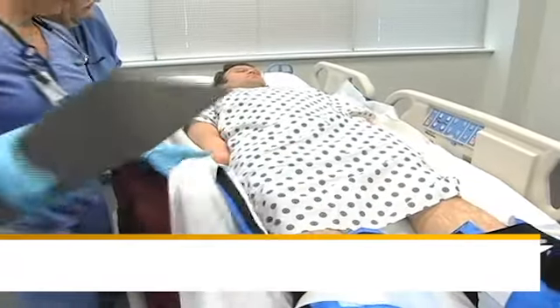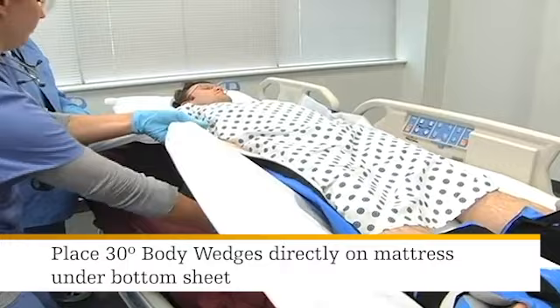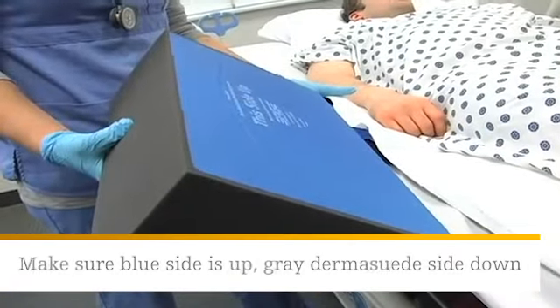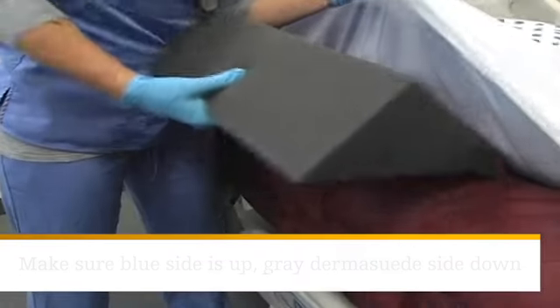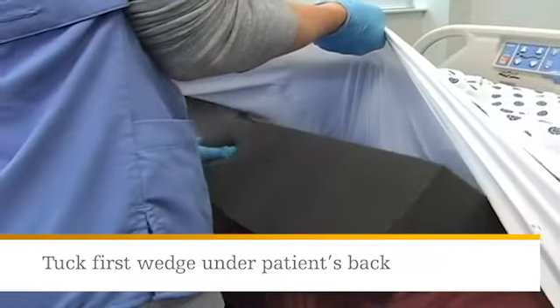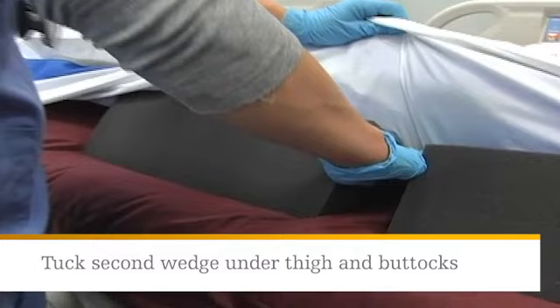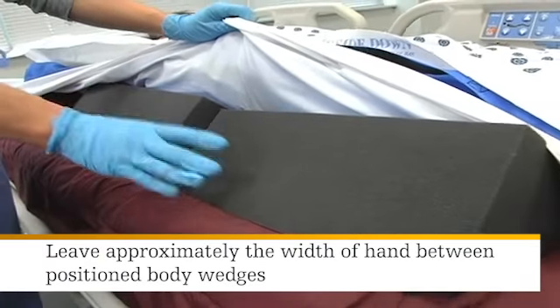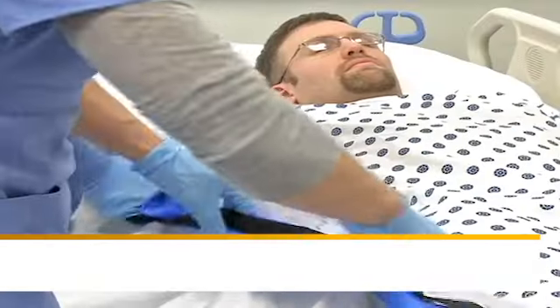Now you're ready to offload the sacrum. Place the 30-degree body wedges directly on the mattress under the bottom sheet — this will work with flat or fitted sheets. Make sure the blue side is up and the gray derma suede side is down. Tuck the first wedge under the patient's back, making sure the base of the wedge is on the mattress. The second wedge should be placed under the patient's thigh and buttocks. Leave approximately the width of your hand between the positioned body wedges at the sacrum — this will allow you to check that the patient's sacrum is offloaded.